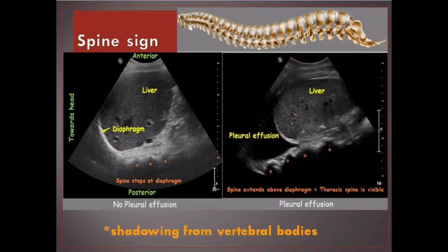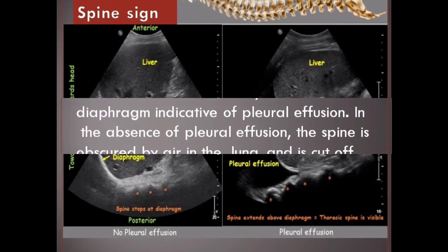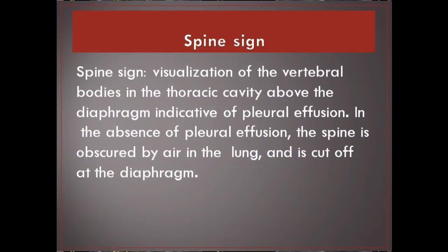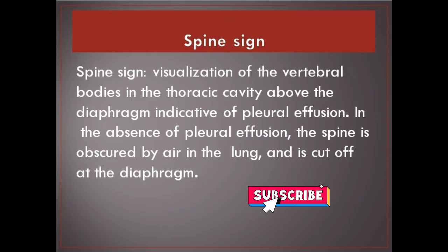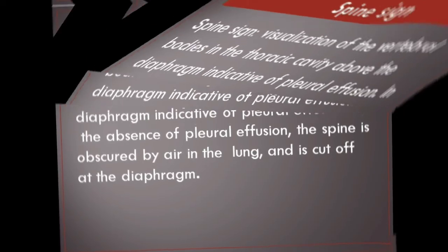Spine sign. Visualization of the vertebral bodies in the thoracic cavity above the diaphragm is indicative of pleural effusion. In the absence of pleural effusion, the spine is obscured by air in the lung and is cut off at the diaphragm.